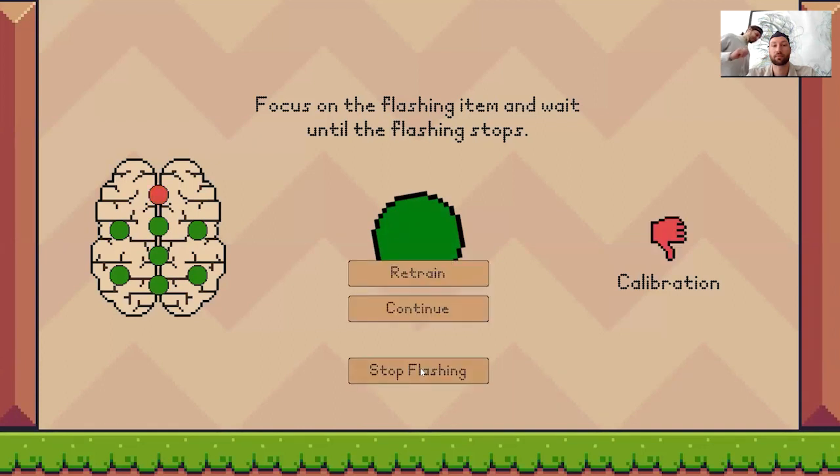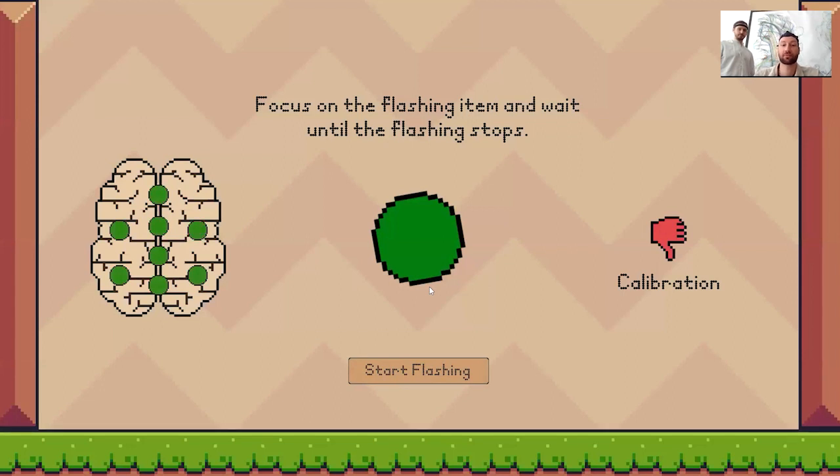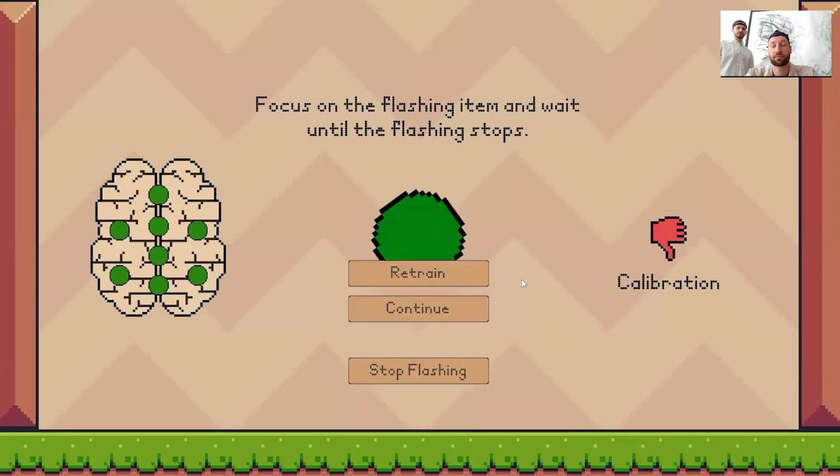We got a bad classifier. Let's redo the training. Looks like Leo is still sleeping. Start flashing. Still not good. Maybe let's give it a third try, if Leo is not able to control this P300 at the moment, and then we're going to the APIs.